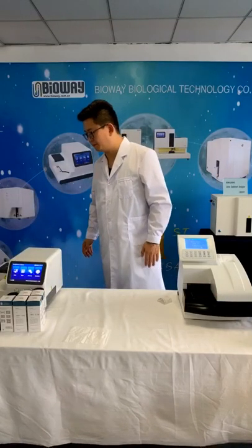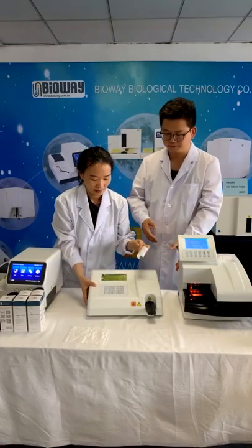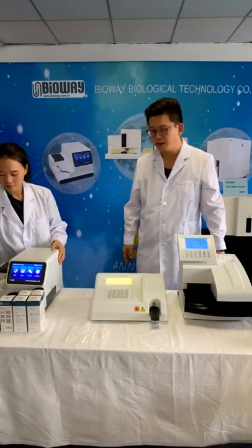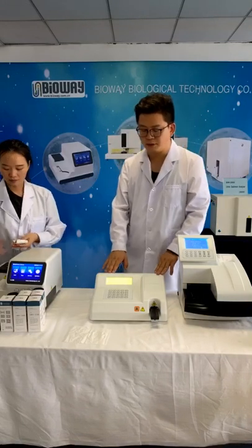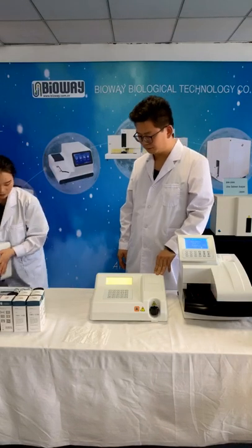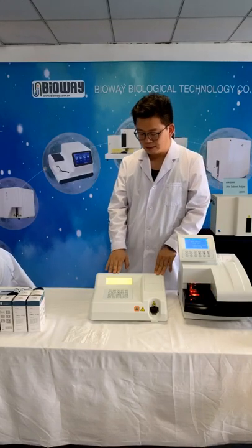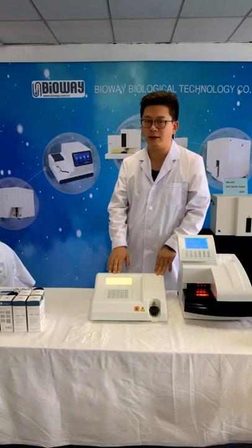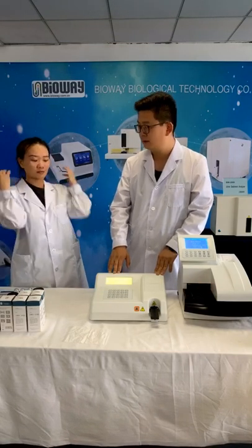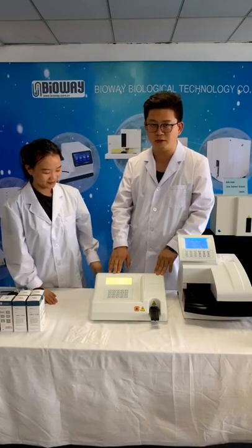BW 200. This device is a semi-urine analyzer, semi-automatic. All the semi-automatic urine analyzers have the self-checking process after being switched on.